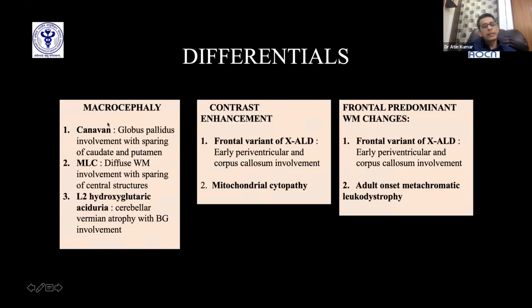So macrocephaly was again Canavan's, MLC, and even L2-hydroxyglutaric aciduria, but Canavan's and MLC we've discussed pretty well. Contrast enhancement: we saw a case of Alexander disease today, which has contrast enhancement, and the last time we saw a case of X-linked ALD. So basically, there are predominantly only three main types of leukodystrophies which show contrast enhancement. We need to remember this because we don't want to give contrast in all the cases. We want to give contrast only when we are suspecting specific indications.